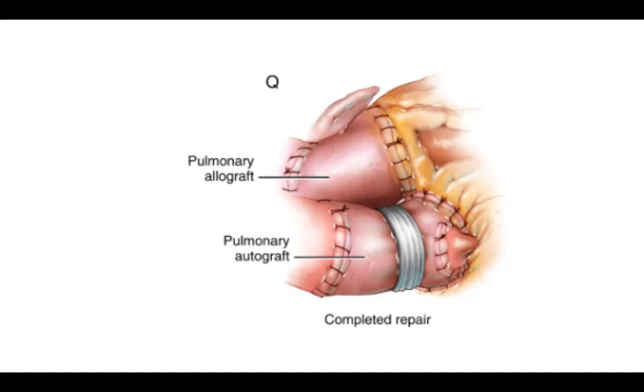For example, if you mandate a tissue valve, a sutureless aortic valve has better performance in terms of the gradient, and that will translate to less patient prosthesis mismatch. Or you will go to a low profile prosthesis, which is a mechanical valve, to avoid that. Or you plan pre-op that you will do aortic root enlargement to avoid patient prosthesis mismatch.